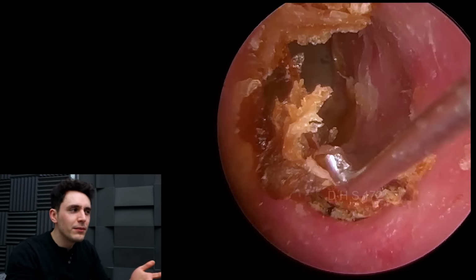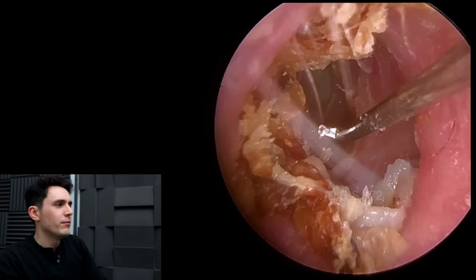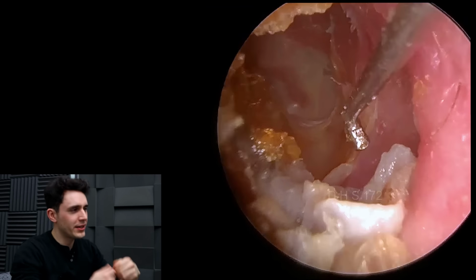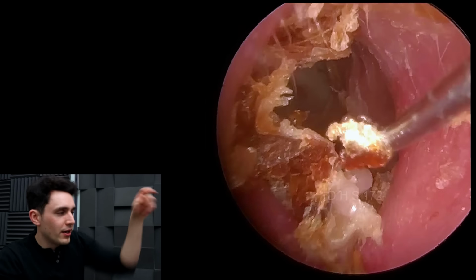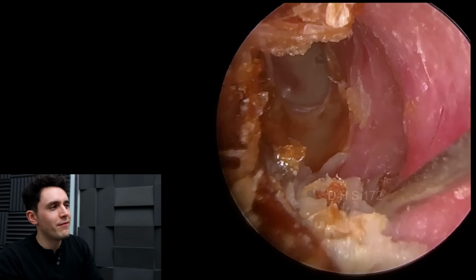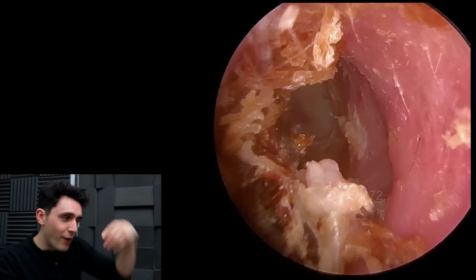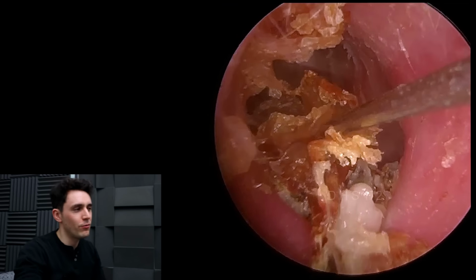I say mistake, I mean there's a little bit of trauma to the ridge of the crater, but kind of unavoidable. But what I really needed here was maybe a, I don't know if such a thing exists, but like a double kinked hook, or just a kinked hook. So the rod of the hook has a bend in it, and then I could delve that into the crater, which is probably something you would never do unless you knew what was in there. Because if you go back and watch the original video, I know how it is because I've shoved an angled endoscope in there to look into the crater, so I knew how deep it was.